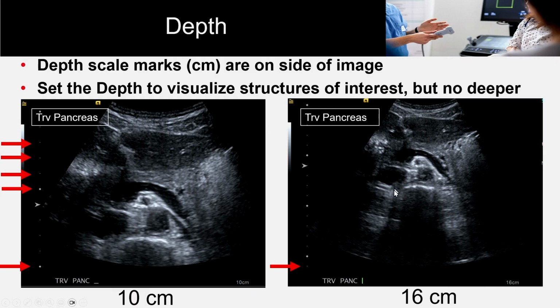Why? Because you have this unnecessary landscape over here. You have the vertebral body with everything shadowing behind it because it's bone and the sound won't penetrate. Psoas muscle or paraspinal muscles on the left side, psoas and paraspinal muscles on the right. Not a great modality to look at the retroperitoneum. So again, adjust the depth once you decide on the frequency and the gain.